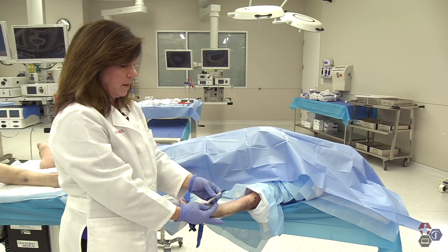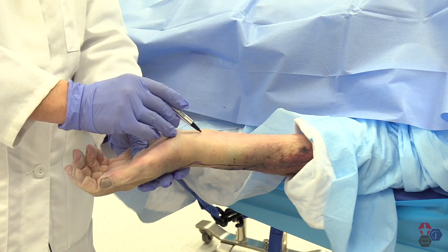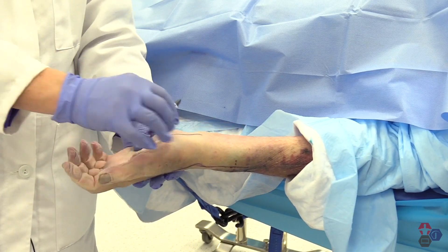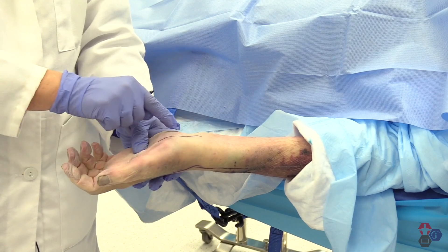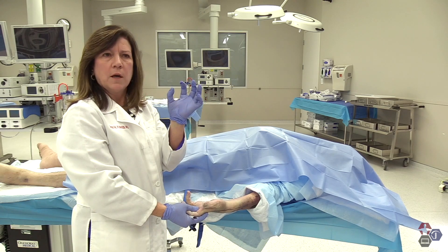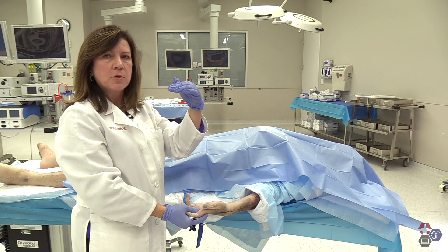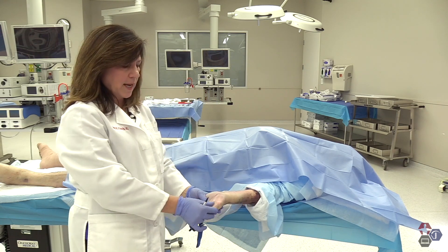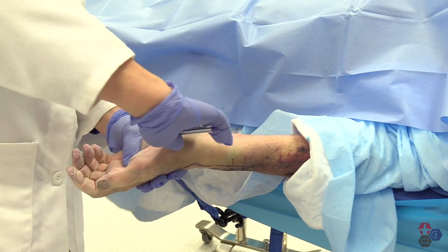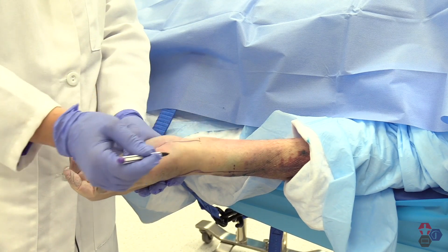The last nerve in the wrist I'm going to talk about is the median nerve. The median nerve runs through the carpal tunnel, right at the middle of the wrist at the flexion crease. The carpal tunnel is bony on three sides and has a very dense flexor retinaculum over the top, so it's not compressible or distensible. We want to stay out of the median nerve and the carpal tunnel, so we're going to go two finger breadths above, and that's where I'm going to lay that down.